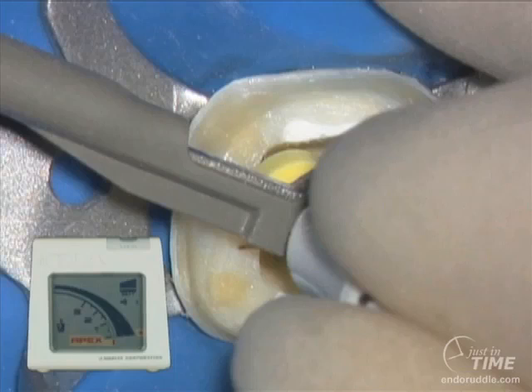I'm not working 1 millimeter short or 1/2 millimeter short. I'm actually working to the apex, which means you'll get an audible noise and you'll also get a light flashing. So 3 things will confirm you're where you want to be: the digital readout, the audible beeps, and the lights flashing. Now, how do you know if the apex locator is telling you the truth?